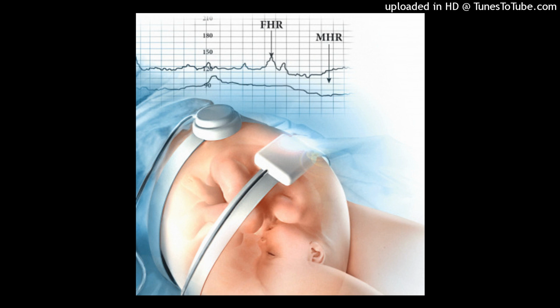Resting tone is the amount of intrauterine tone when the uterus is at rest, described as soft or relaxed when normal and firm, or not relaxed when abnormal, with palpation or millimeters of mercury with an IUPC. Normal resting tone is approximately 10 millimeters of mercury with an IUPC, and hypertonus is greater than 20 to 25 millimeters of mercury with an IUPC.